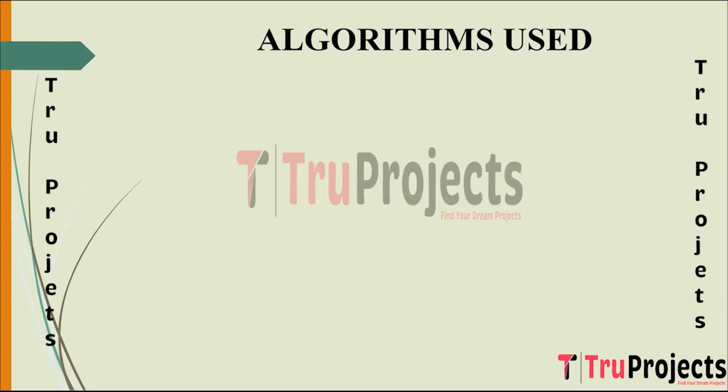Algorithms used. In this project, we have utilized the following algorithms. The first algorithm is ResNet50. ResNet, the residual network, is a popular deep learning architecture known for its deep layered structure. ResNet50 specifically refers to a ResNet variant with 50 layers, utilizing residual blocks to address the vanishing gradient problem in very deep networks. It introduces skip connections, allowing the network to learn residual functions, enabling the training of deeper networks without encountering degradation issues.